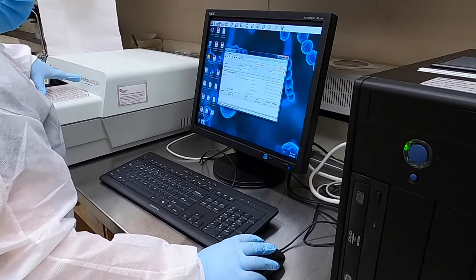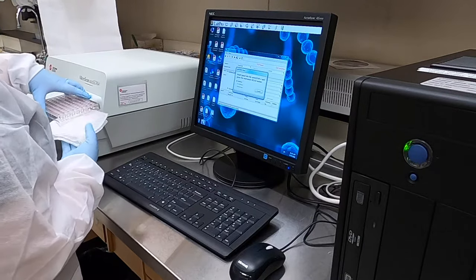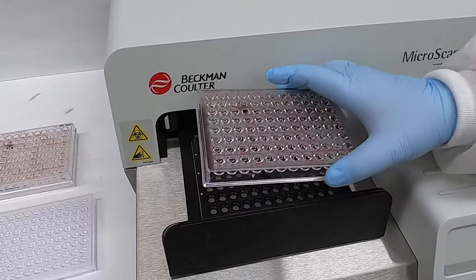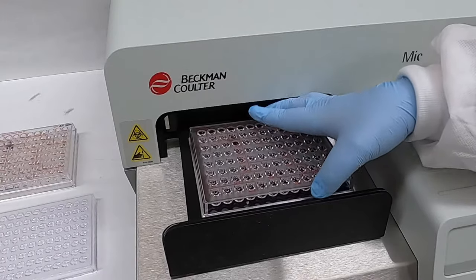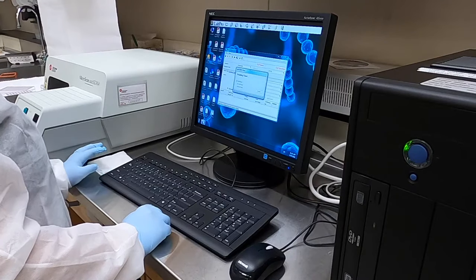We start by inputting all of our sample characteristics into the computer program, including the patient ID and the bacterial species, load our plate into the carousel, and then the machine automatically reads our plate for us.